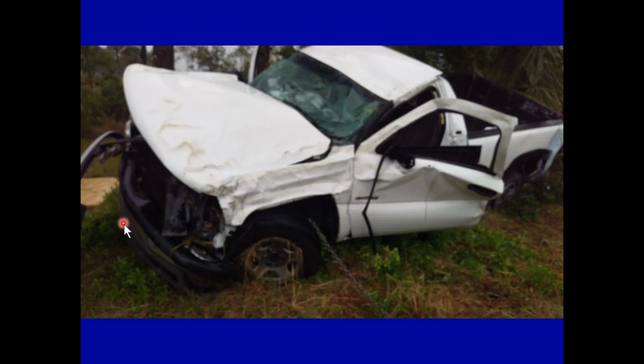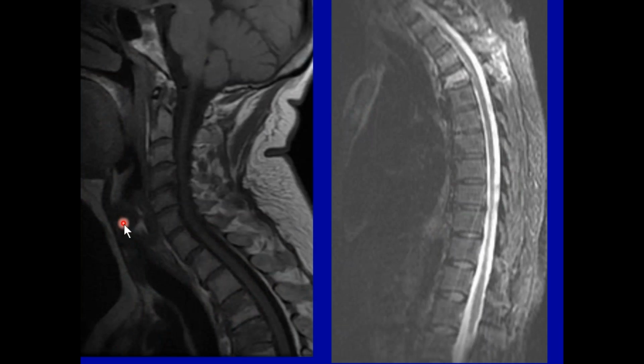She was trauma-hawked, or airlifted, to the nearest trauma center, which was a godsend. She had an MRI done of the cervical spine, and by the time I got there, they had already done this examination because that's the protocol at a trauma hospital. So where the laser pointer is now is cervical spine. I know it's a little on the dark side, but this is normal.